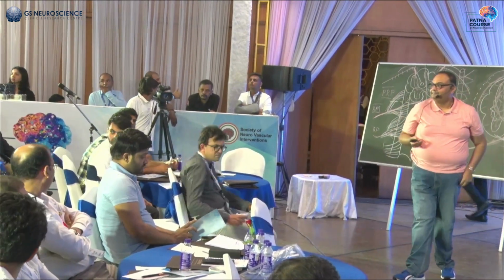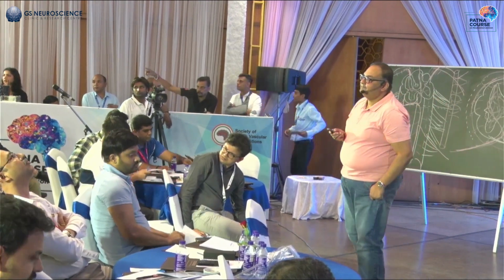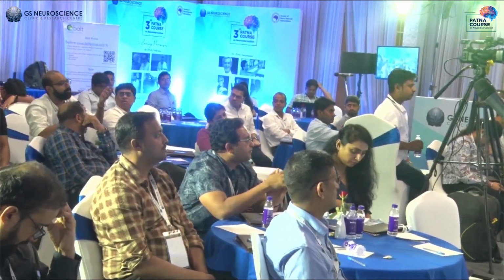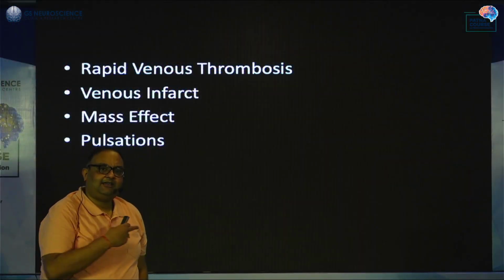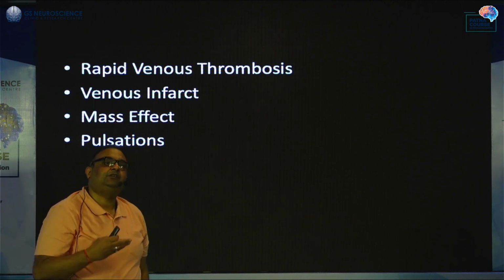Kaushik? That gives us an advantage because the shape is also like that, that doesn't shift off. Any idea on that 5 French? We basically reshape all these catheters according to the case. Okay. We reshape the 4 French. We fine tune the shape according to the anatomy.